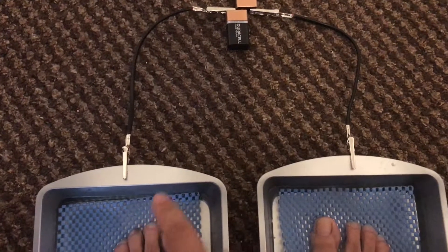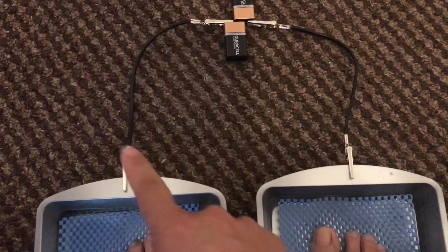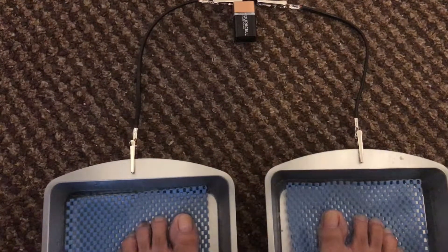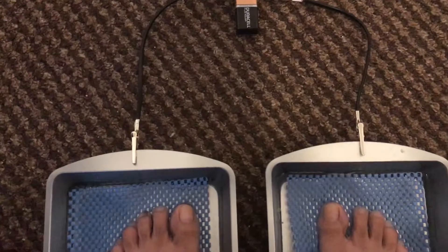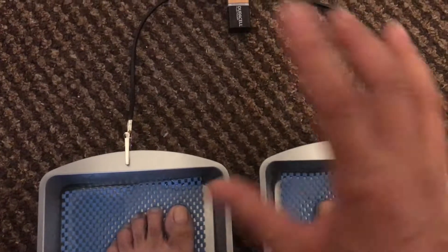So after 30 minutes, you have to exchange this one and this one, so that it will treat equally, because the positive is stronger than the negative. So after 30 minutes, you have to exchange it.